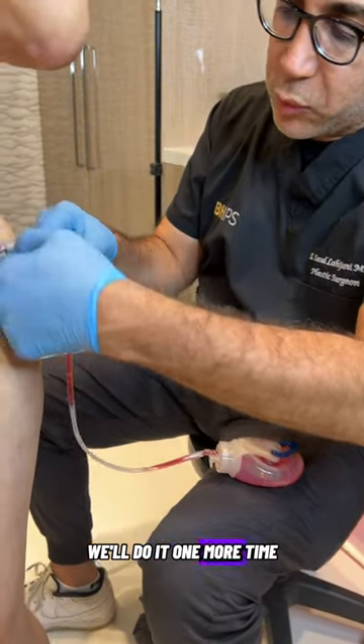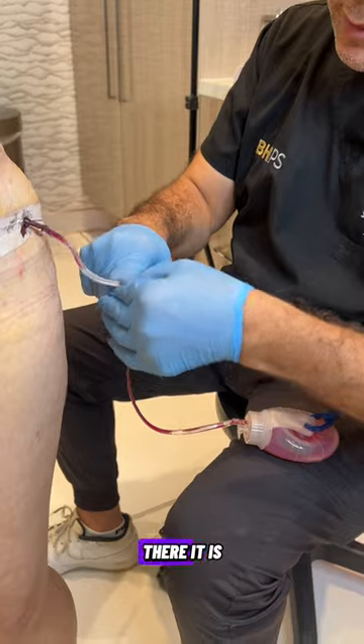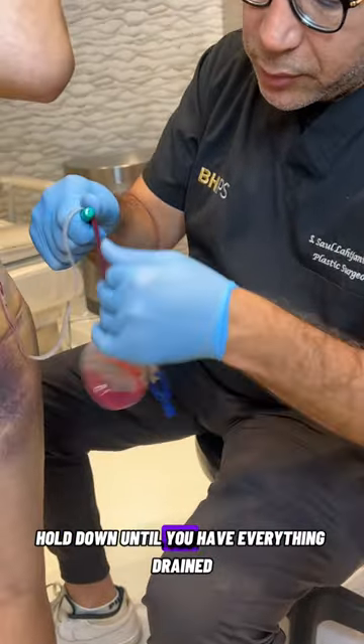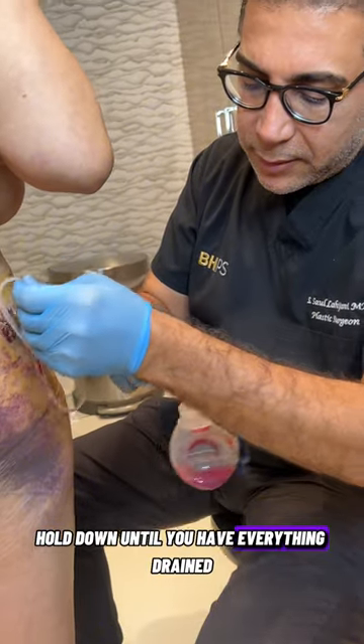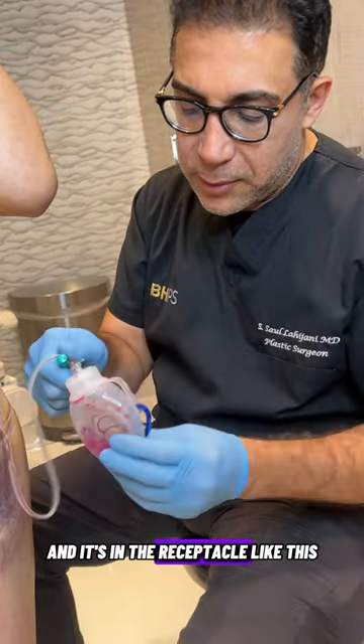Again, we'll do it one more time. Hold it here, pull down — there it is. Pull down until you have everything drained and it's in the receptacle like this.